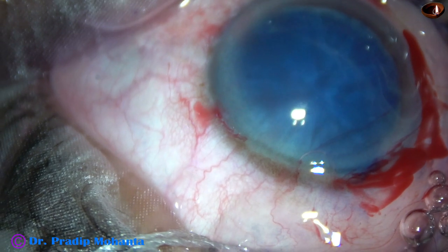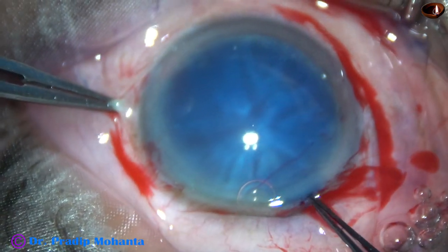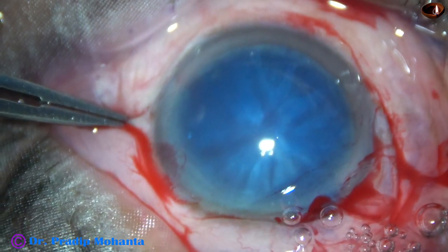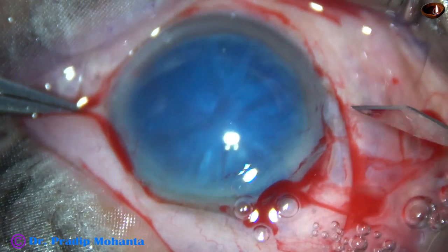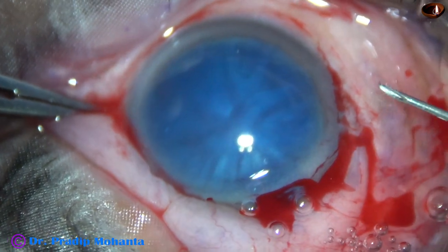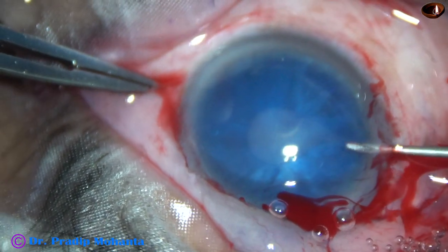Now I am going to try capsulorrhexis with forceps. But see what happens — I am not able to puncture the anterior capsule with the forceps. This happens when the zonule is weak; you cannot pierce the anterior capsule. So I am making a side port. Through this side port, I introduce a sharp 26-gauge disposable bent needle.